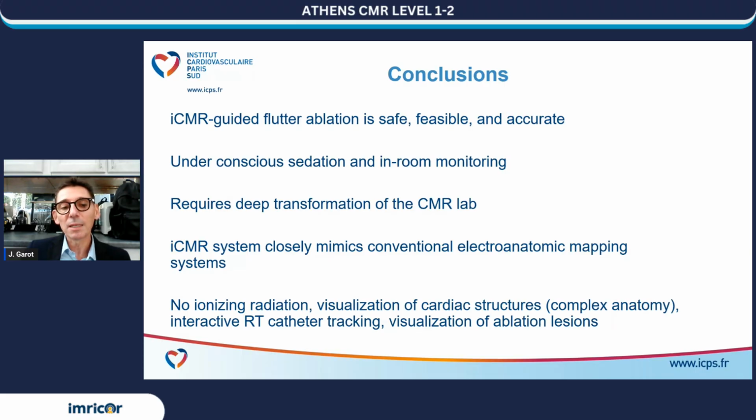You can visualize all cardiac structures and surrounding anatomy and the complex anatomy of the isthmus. The interactive catheter tracking is mandatory if you want to do this technique in safe and convenient conditions. And interesting to notice that you can visualize the ablation lesions, and that can be really interesting for the prediction of outcome. Thank you very much for your attention.